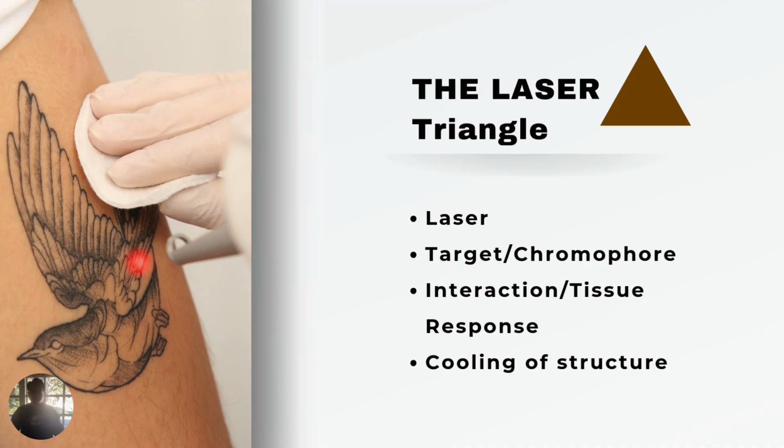Keep in mind the laser triangle. We consider the laser and what we've learned today, the target, its importance, on how it absorbs the energy. We need to know the tissue interaction, the response of the tissue. Let's practice clinical common sense. Assess, assess, assess.